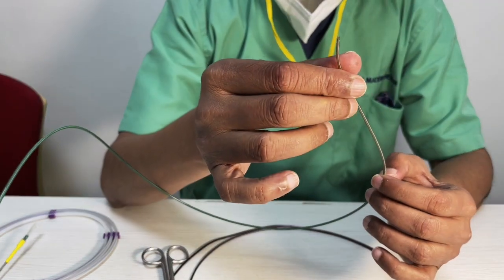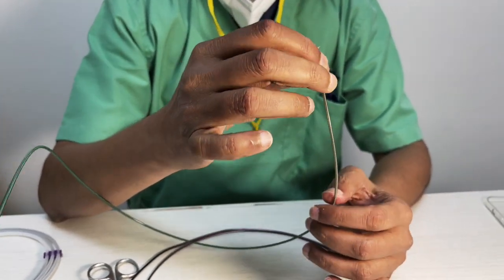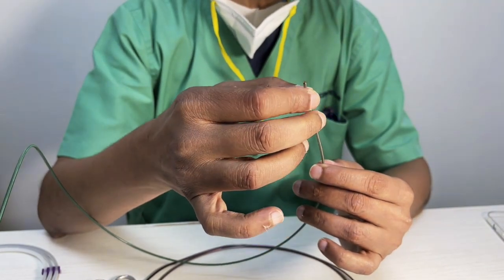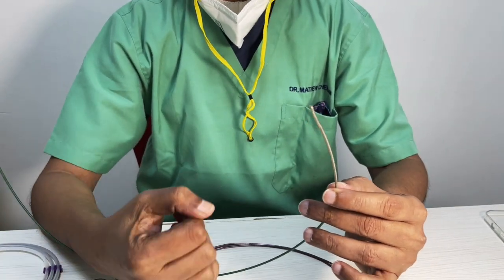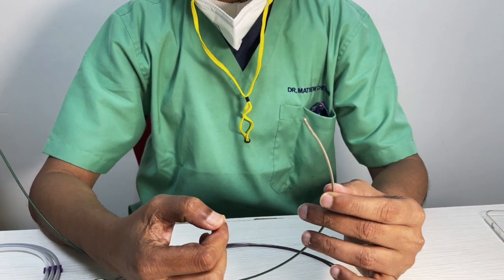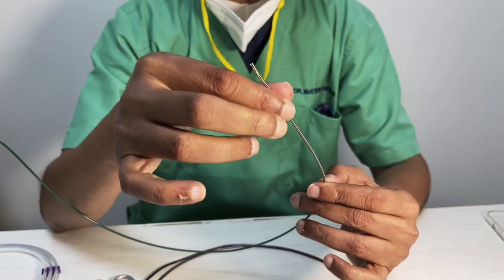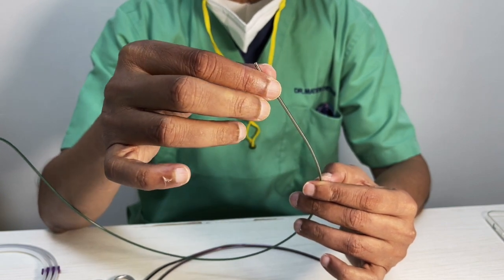And most of the companies actually will use a PTFE liner inside. And here I am not even seeing the PTFE liner if it is there. But the PTFE liner's biggest advantage is this, that if you want to pull in a metal device like a stent retriever, then without a PTFE liner, it will tear. So you can see this, that in the distal end, there is no PTFE liner because this is meant to just take microcatheters, balloon catheters, and nothing more stiffer.